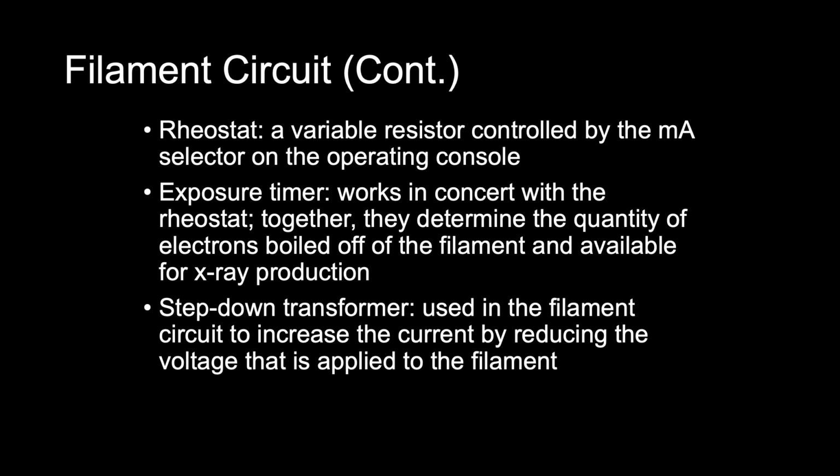Although the step-down transformer does reduce the voltage that is applied to the filament, we are concerned with the current through the filament. So we generally talk about the output current of this transformer rather than the voltage. Remember that as voltage decreases, current increases, and they are inversely proportional.